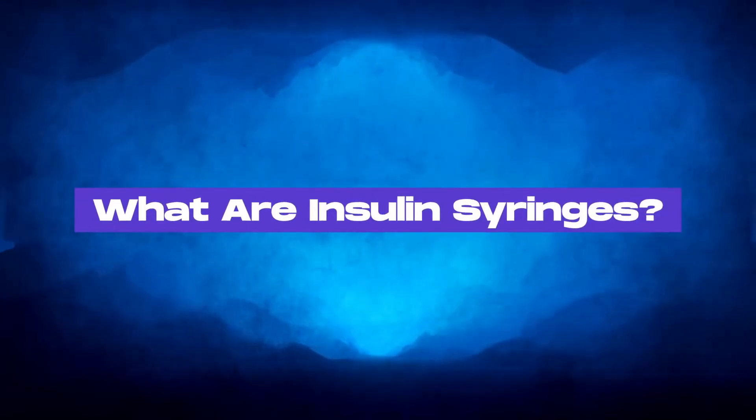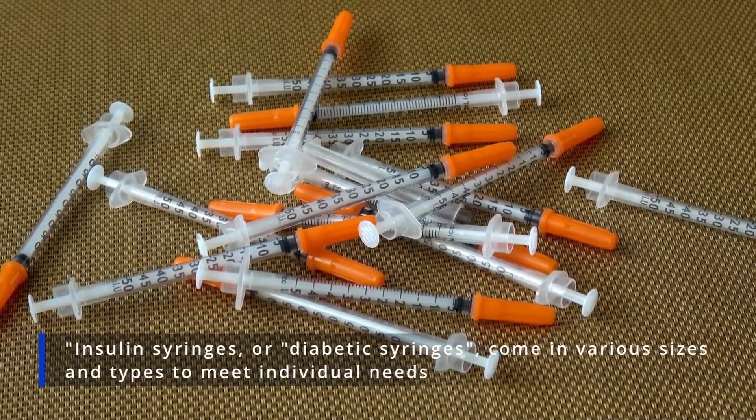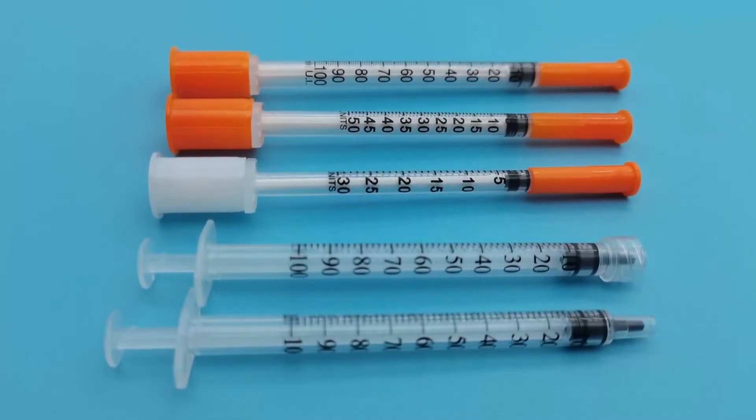What are insulin syringes? Insulin syringes, or diabetic syringes, come in various sizes and types to meet individual needs. They differ in size, needle length, gauge, and unit measurement.